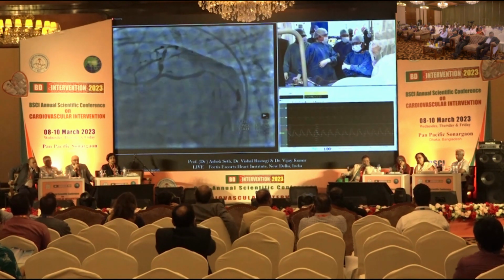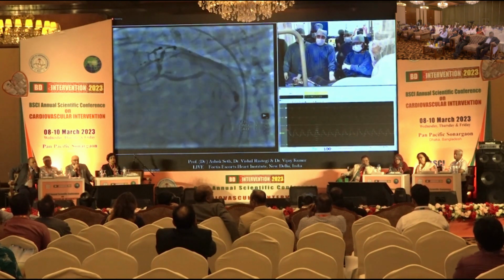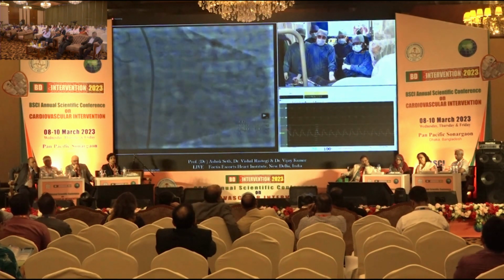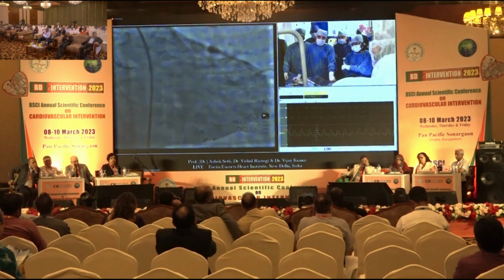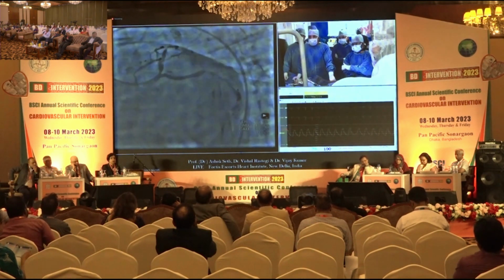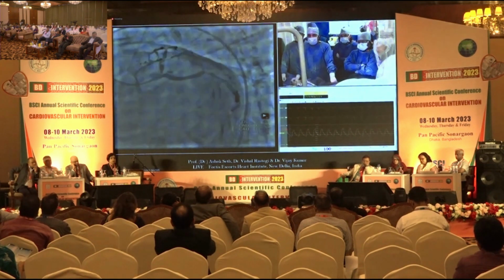You can see that again in this view, both the circumflex stenosis as well as the LAD bifurcations. There's some ostial disease as well. I think that was seen in the ostial LAD disease, which was seen well on the previous caudal projection. Let's go to the previous one, and you can see that ostial disease looks 50%. Doesn't look critical, but we'll know that very soon.